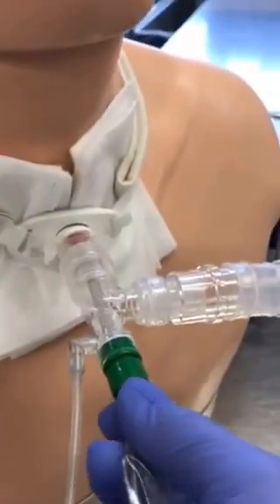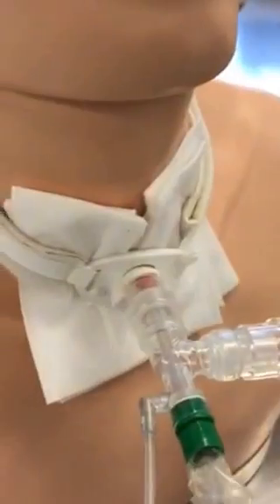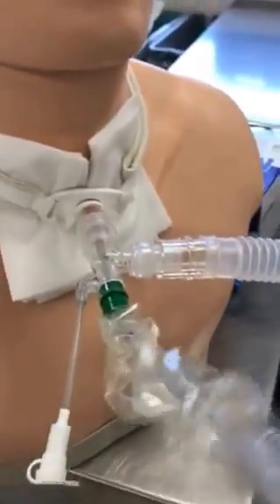And just a little FYI, if you ever get stuck on this, make sure you twist the suction and then thread it. Then you can go down and suction all the way out.